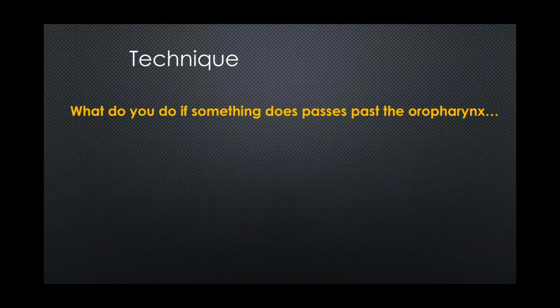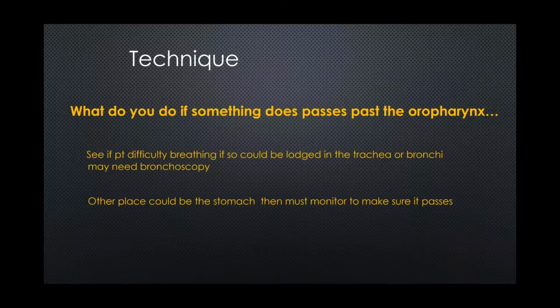What happens if we're going to take the tooth out and all of a sudden you realize that you didn't use the throat pack, or your throat pack wasn't in a good position, and that tooth just flips back and we lose sight of the tooth? Where is it? Well, the first thing you want to do is take a look around the patient's mouth. Maybe it fell underneath the flap that you're developing. Maybe it went underneath the patient's tongue. Maybe it moved itself into the buccal vestibule in the posterior. Just take a quick look around the patient's mouth.